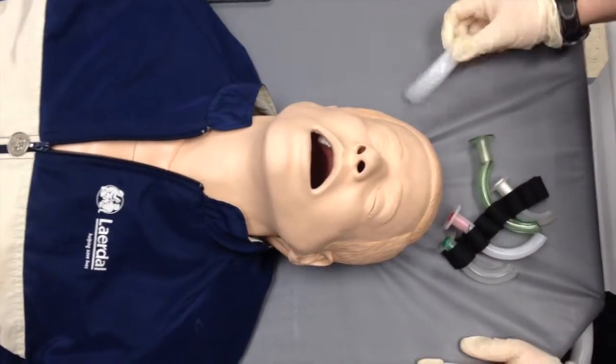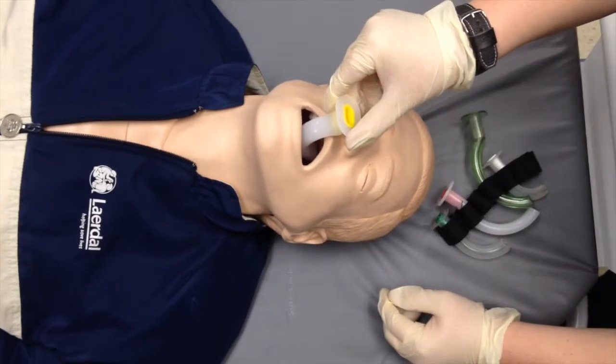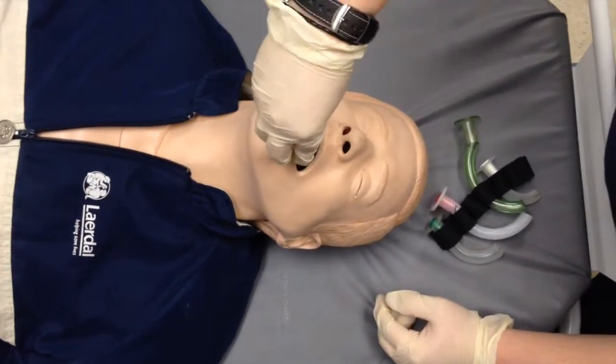Insert the airway with the curve facing upwards until inserted halfway, then rotate the airway into position.